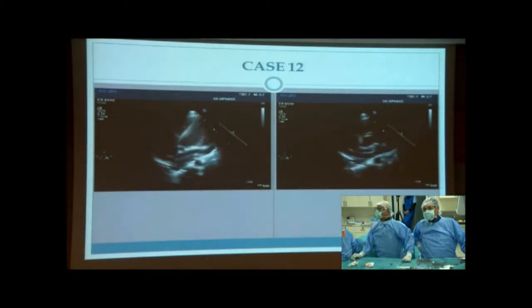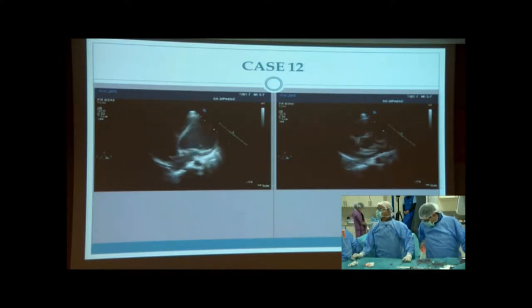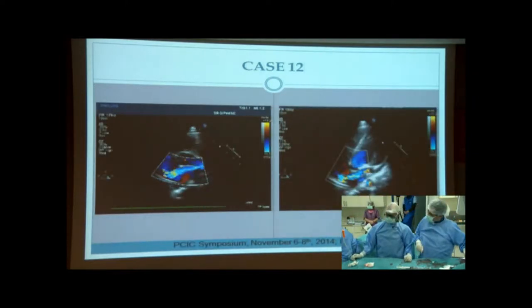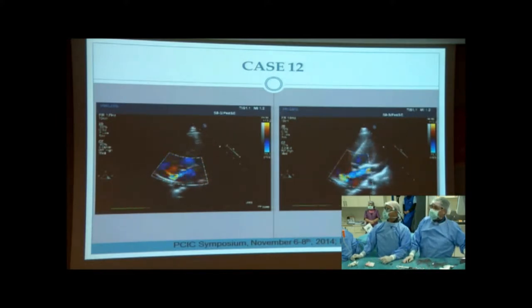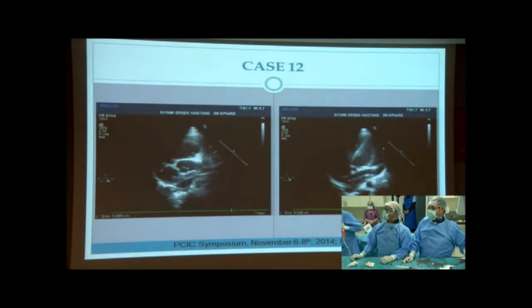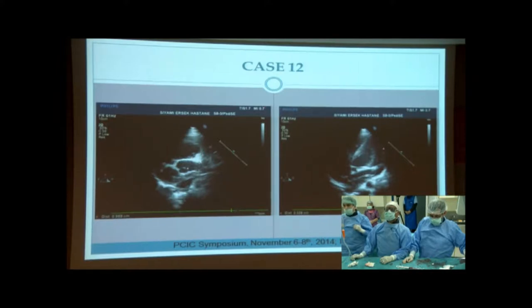Here you can see the large coronary fistula on the images. And here are the colored images of the fistula. Its diameter was 9.6 mm at its origin and 3.2 mm at the right atrium side.